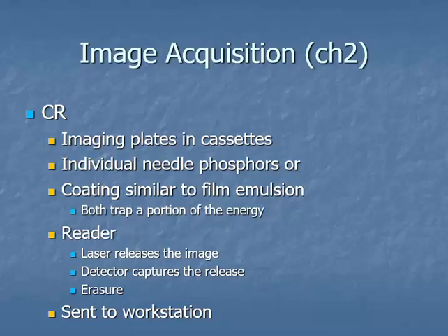The technology for computed radiography was more similar to screens and films. So when we made that conversion from screens and films to a digital type of image capture, the most logical and most economical first step was to change to computed radiography before digital.